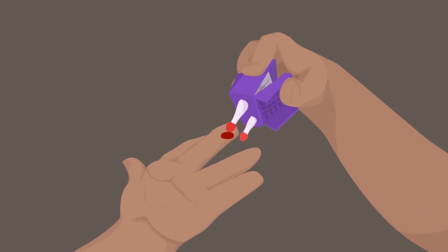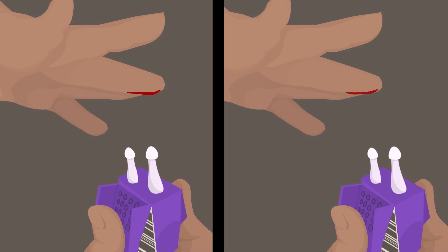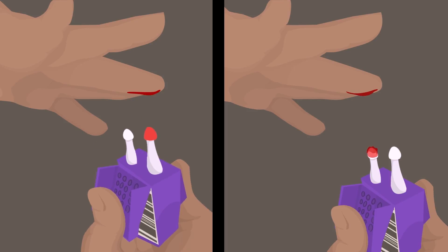Remember not to submerge the entire microsampler tip in blood. Don't sample from a negative angle and don't drop blood onto the microsampler from above.